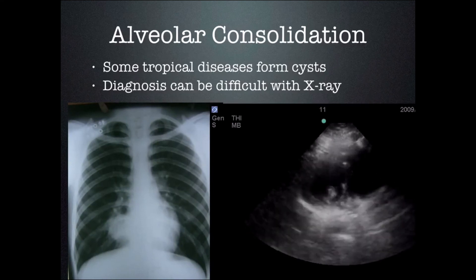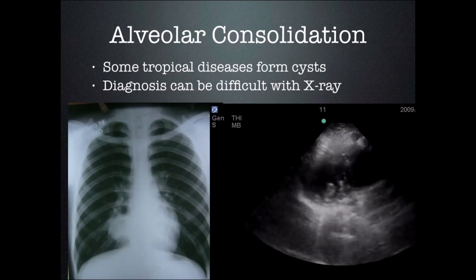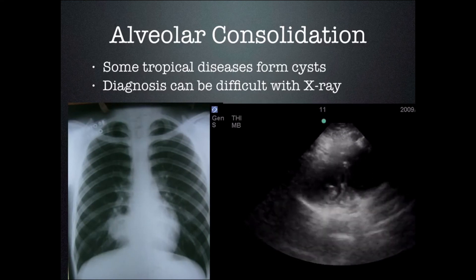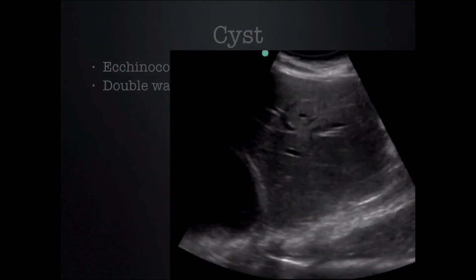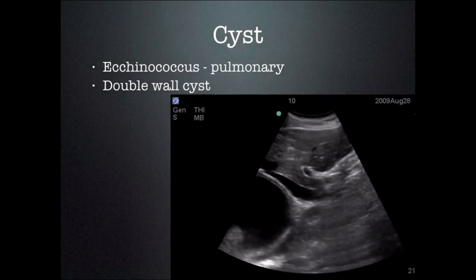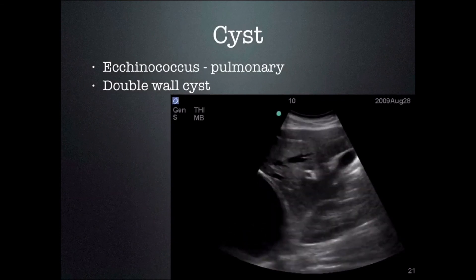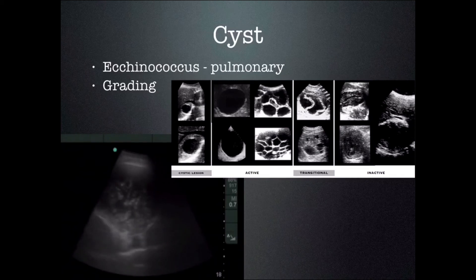Some tropical diseases will also form cysts in the lungs. You can make this diagnosis with CT scan, but you may not have a CT scanner available, and on chest X-ray it can be difficult to characterize the mass. Echinococcal cysts have a double wall — here we have a diaphragm-based pulmonary cyst with a double wall, so we would feel fairly certain this is an echinococcal cyst if you were in an endemic area. These cysts follow the same grading scale as those found in the abdomen: either the WHO classification for echinococcus or the Gharbi classification. Here we see a cystic mass in the lung that is probably transitional or moving towards inactive.